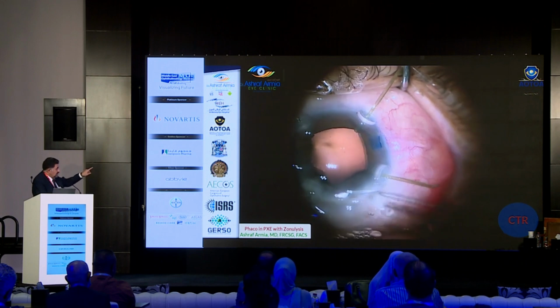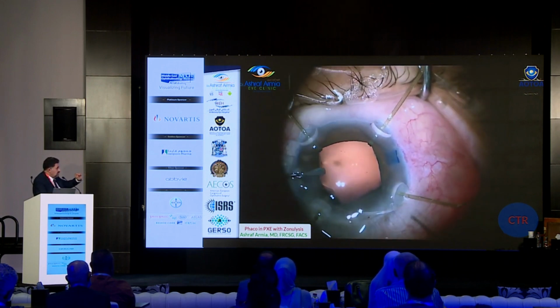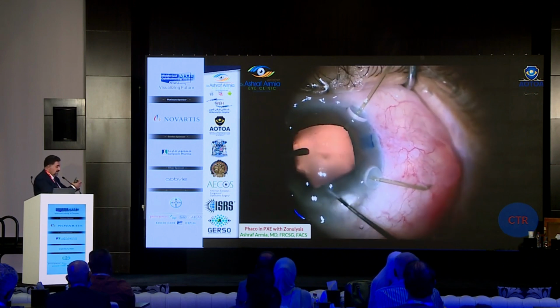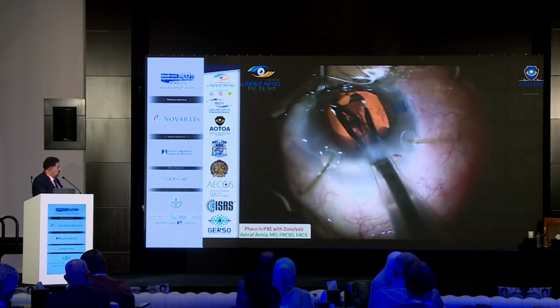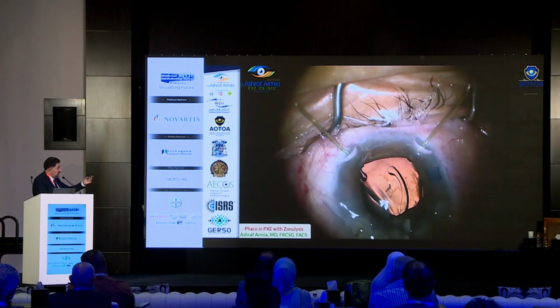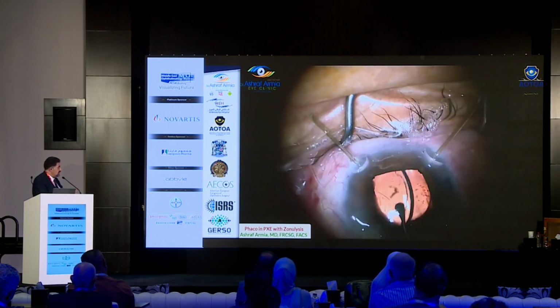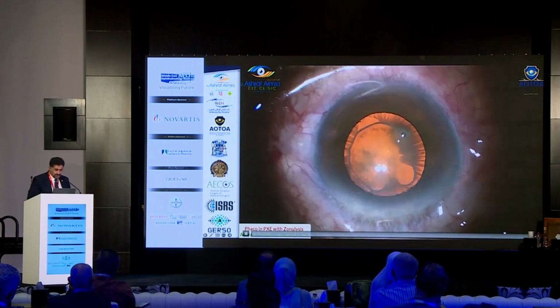And with these modified Shang capsular retractors, the CTR does not get entangled in the holes of the capsular retractors. And now you can find that the bag is still central, everything okay. I put a single piece inside the bag, and then remove the capsular hooks.